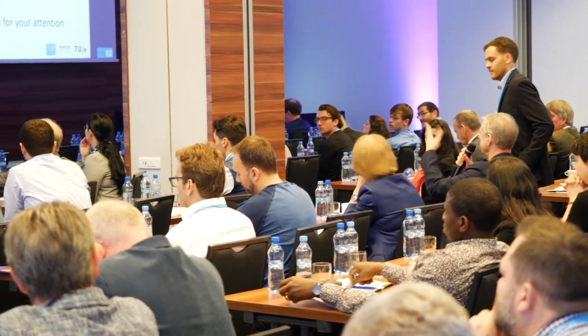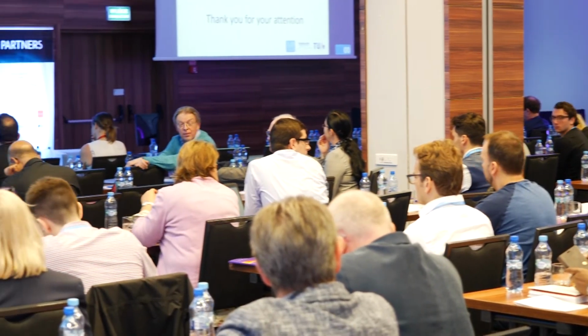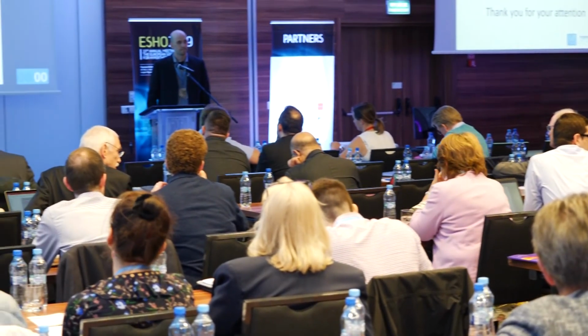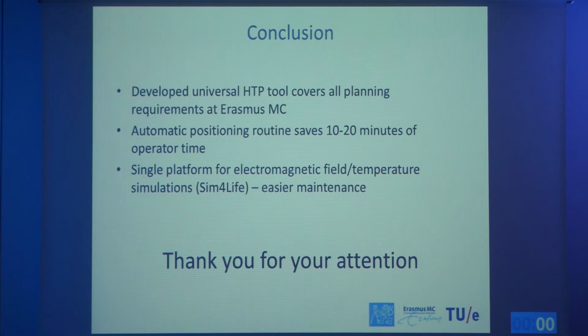This seems to be a very interesting approach to have such a treatment system. What about the segmentation tool? Is it automatic segmentation and manual segmentation as well? Yeah. At this moment, for the head and neck we have an automatic segmentation routine which is atlas based, and the manual segmentation is just to verify that the automatic segmentation is correct.